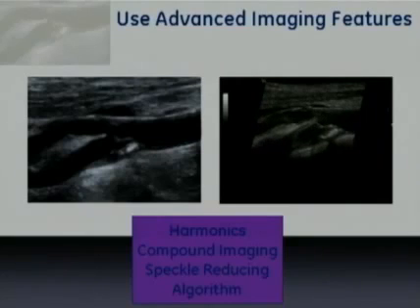Harmonics is particularly interesting because it can sometimes be used to actually visualize the flow. And if we see the flow with harmonics, it's even at a higher resolution than we can ever achieve with color Doppler or with power Doppler imaging, for example. So the image on the right that you see is not some new flow imaging technology. That's simply high-frequency harmonic imaging. And it was achieved by using the highest frequency that would actually penetrate, going into harmonics.